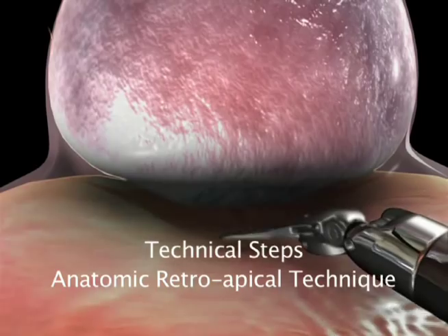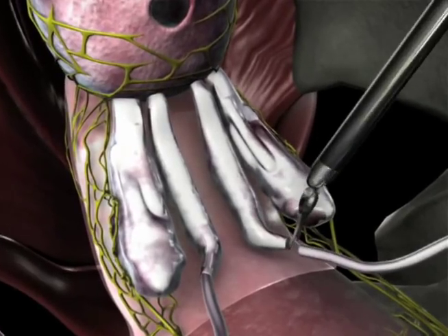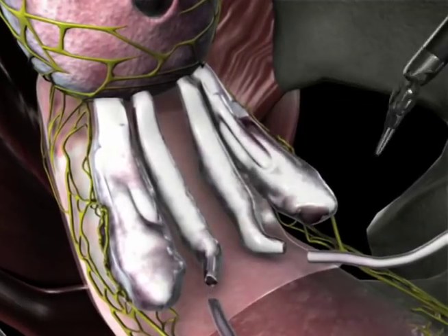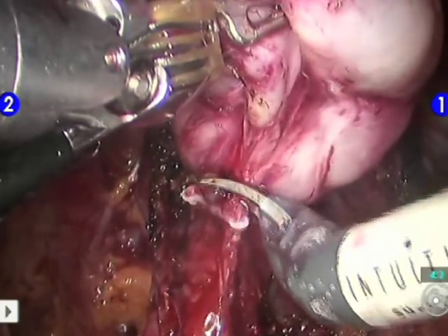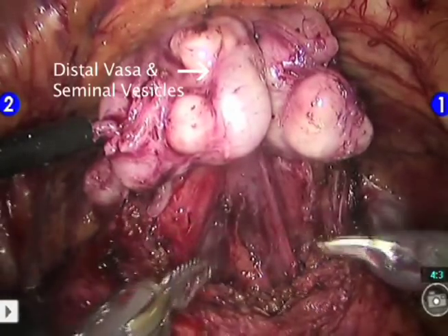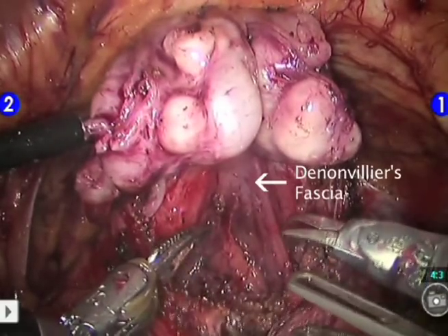Technical steps of the anatomic retroapical technique: Following transection of the bladder neck, we identify the vas deferens and seminal vesicles. We mobilize the vas deferens and clip the proximal end behind the trigone. The distal vasa are grasped by the left side assistant and pulled anteriorly, tenting Denonvilliers' fascia.